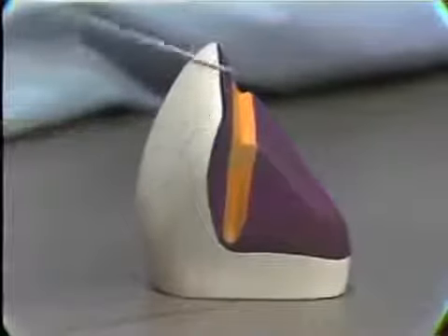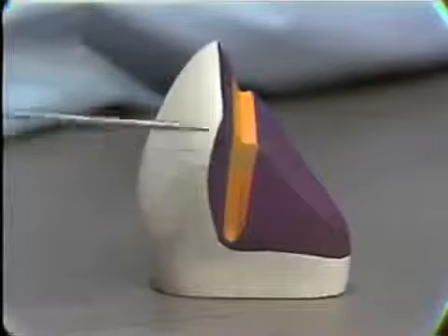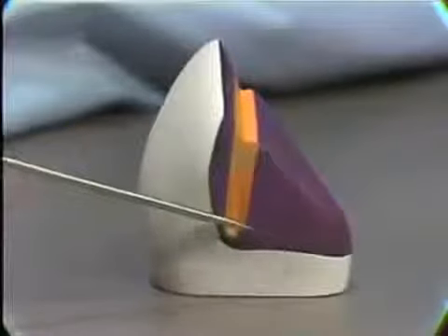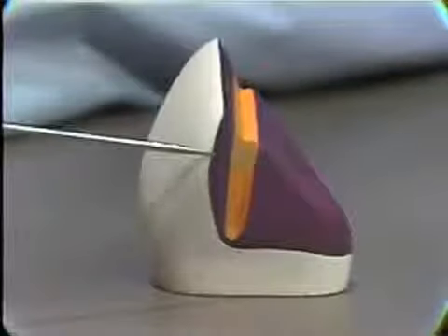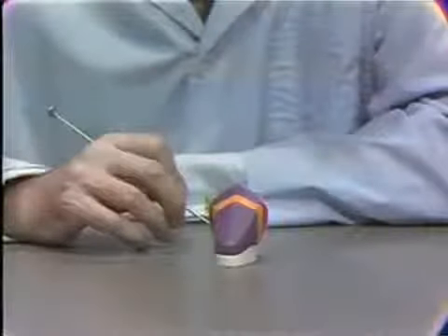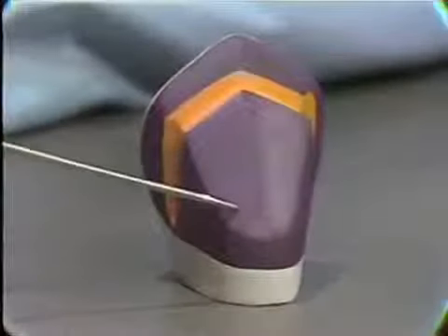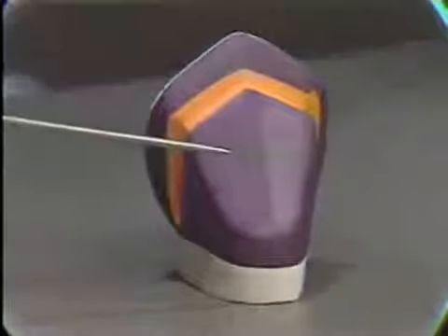As you know, of course, it gets its retention from pins on the lingual surface, not on the proximal, and you have more or less complete control of the proximal design. And if you want, you can stop the preparation much further back in the proximal area than you would with a three-quarter crown. So for this reason, the three-quarter crown is being used less and less in anterior teeth. When we use such a three-quarter crown for bridge preparation, we usually cut a little recess in here, as you have done, and place a pin in there to give added retention.